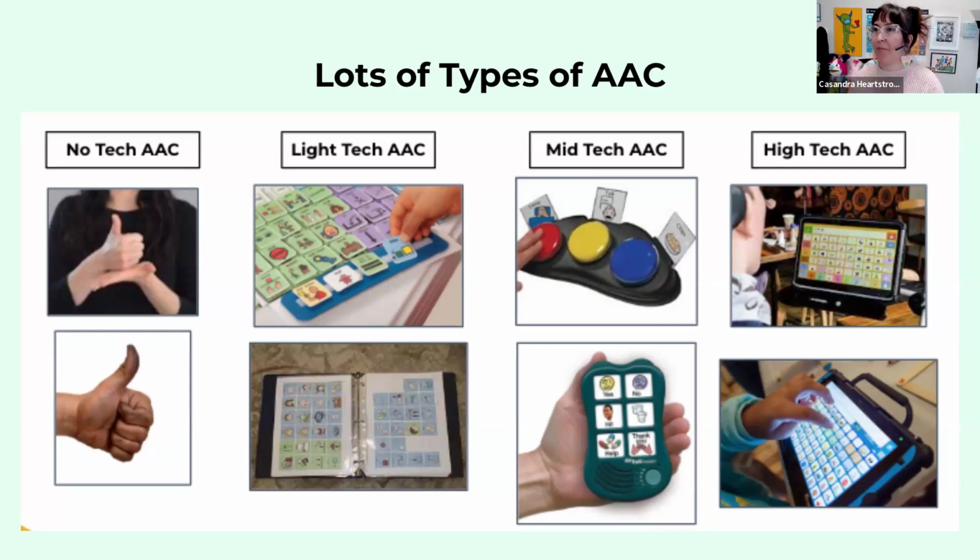Yeah, the buttons don't say enough. It's very limiting. I see in the chat too, it's very limiting. I totally agree. But there are places for it.